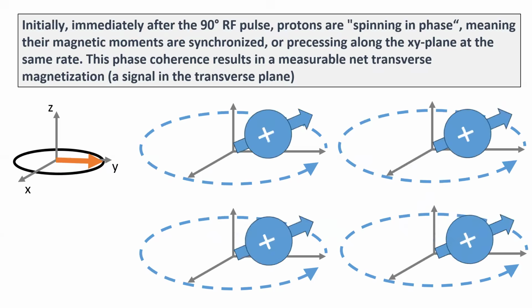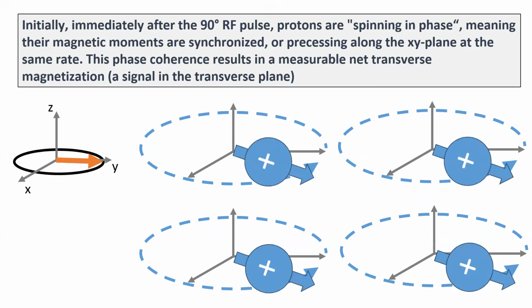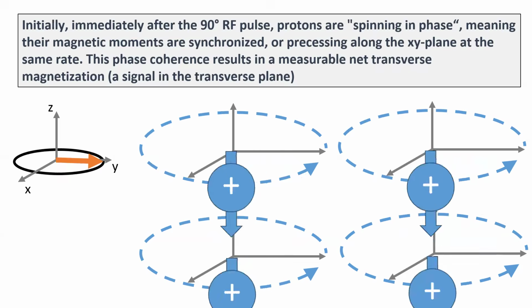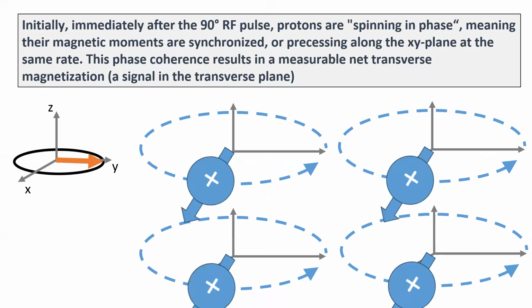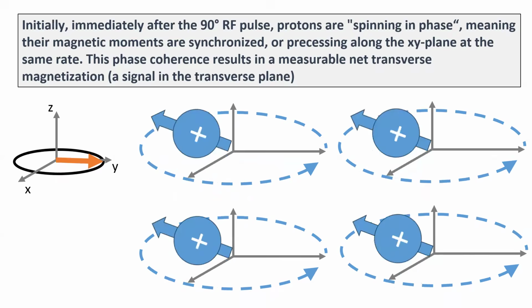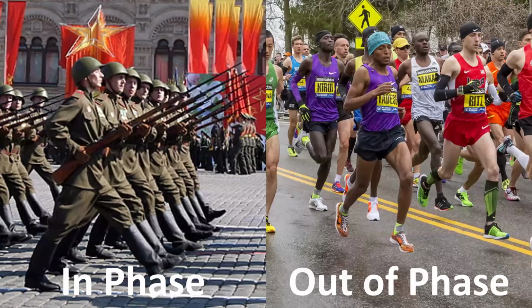And that electrical signal is the basis of our MRI signal. So we're done, right? We managed to do it. We managed to flip the body magnetization in the transverse plane, and now we have created a moving magnetic field that can be detected and translated in electrical signal and images. We're done. Well, no, we're not.